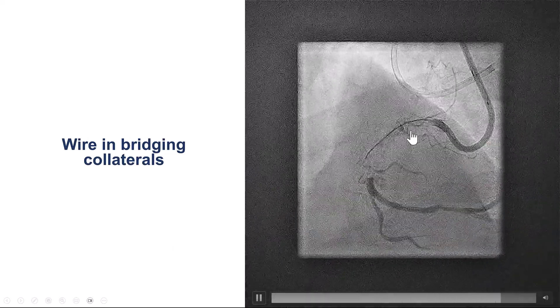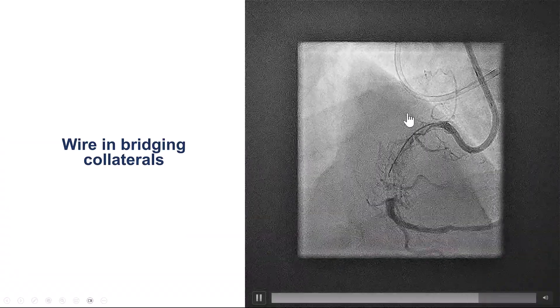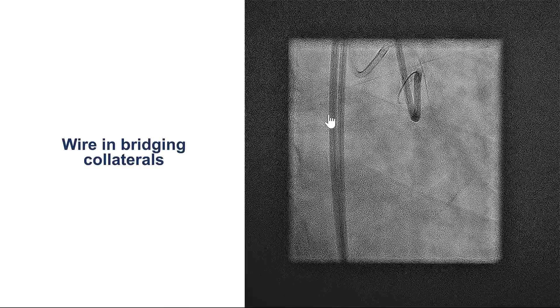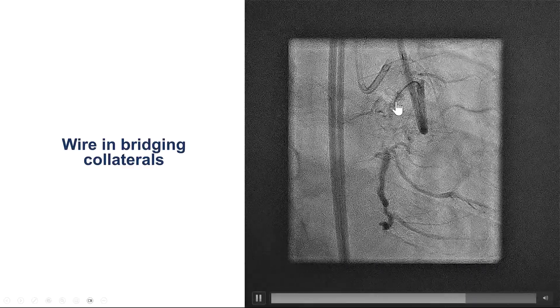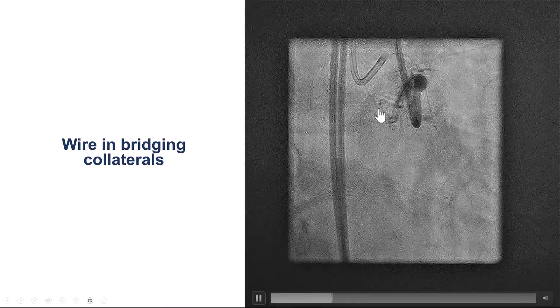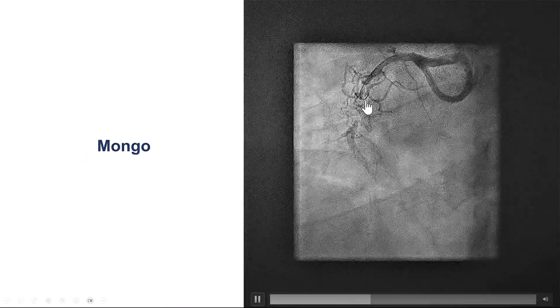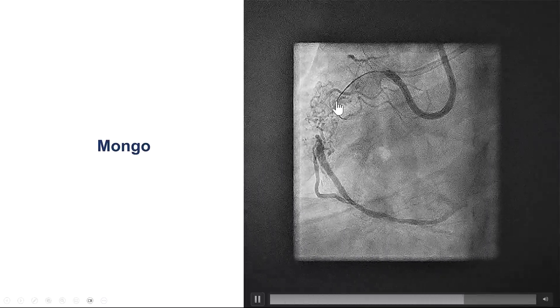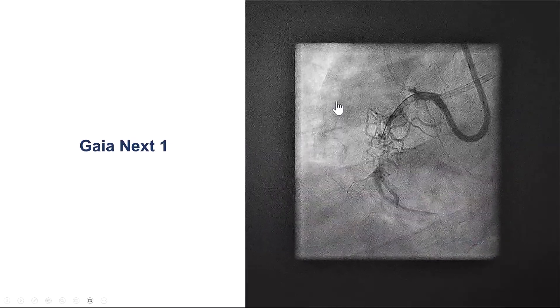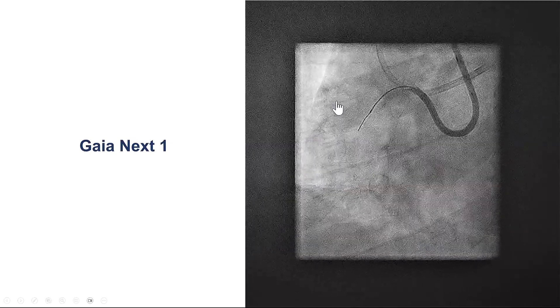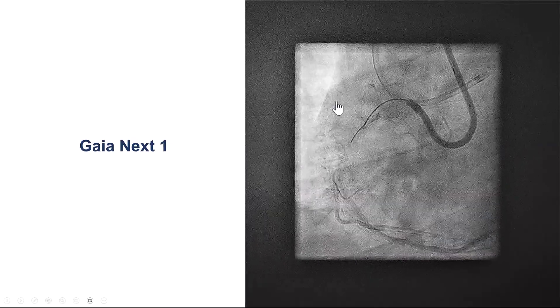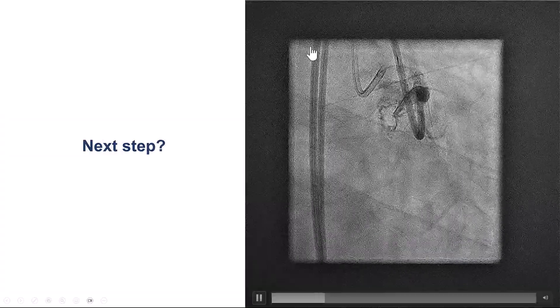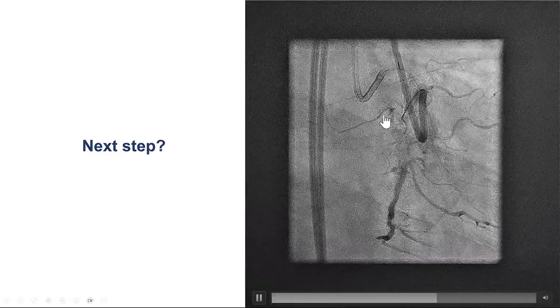As predicted, the antegrade guide wires — polymer-jacketed wires including the Fielder XTA and Gladius Mongo — kept entering the bridges. The same thing can be appreciated in the RAO view. We were unable to advance the guide wire into the cap; it kept entering those bridges and collaterals. We thought a stiffer wire might help stay within the intraplaque segment, but unfortunately the same thing happened. This is a Gaia Next 1, and still it seems to be going into those collaterals.